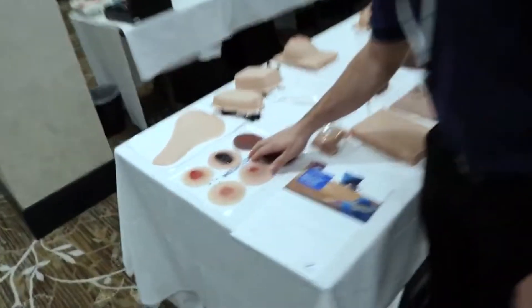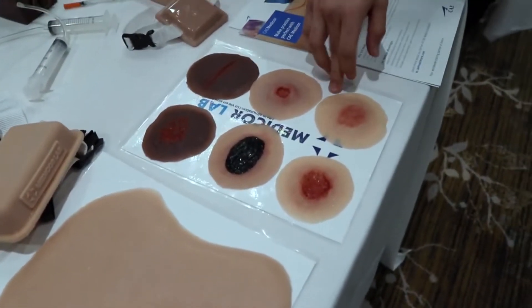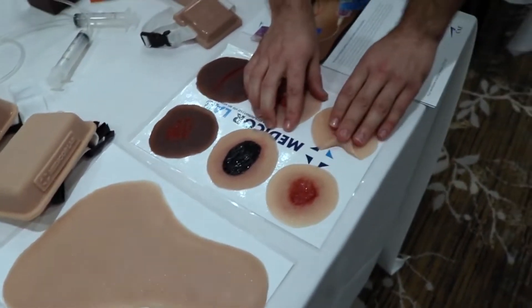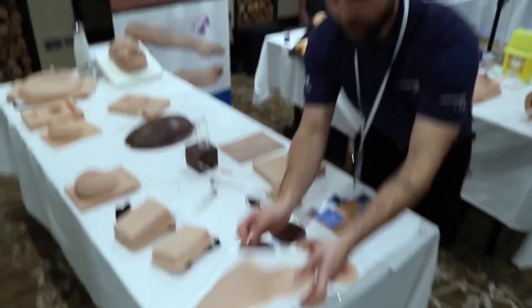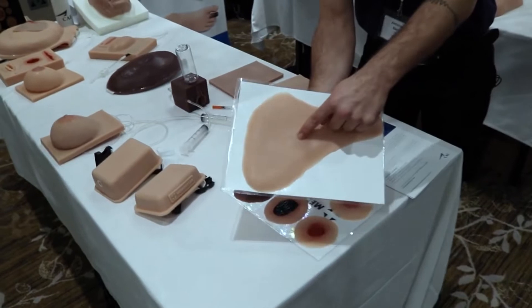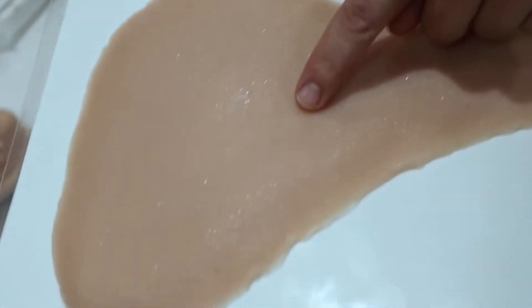Right here we have our sticky wounds that come in packs of 6, 12, 18, and 24. Super sticky, and they will peel right off your mannequin. We also have pitting edemas, or swollen ankles, that provide a perfect mimicking of those swollen ankles.